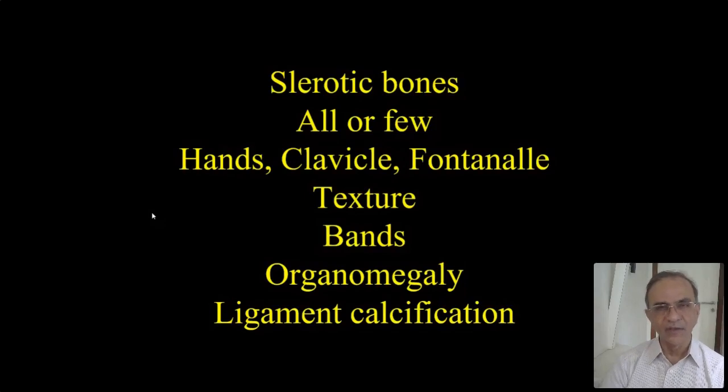So knowing ligament calcification, knowing that there is coarse trabecular pattern, you can differentiate that from the skeletal dysplasia. I'm not even getting into clinical things. If you look at the patient, if you know the clinical findings, all this is unwanted headache. So much is easier. You don't even think of fluorosis if you've seen the patient, if you know what the patient's problem is. But in an exam, you will be asked the differential diagnosis of increased bone density. How do you tell one from the other?